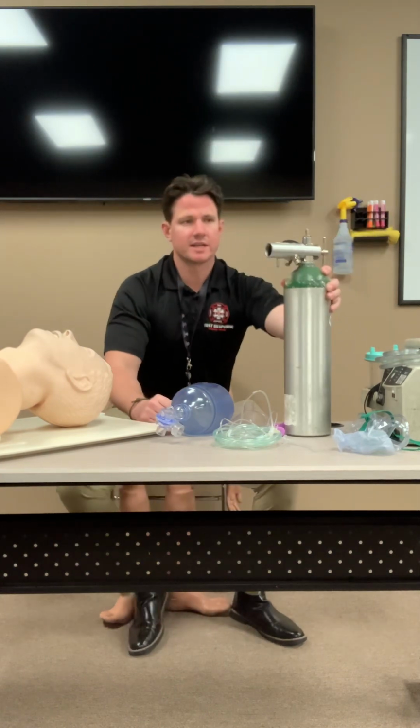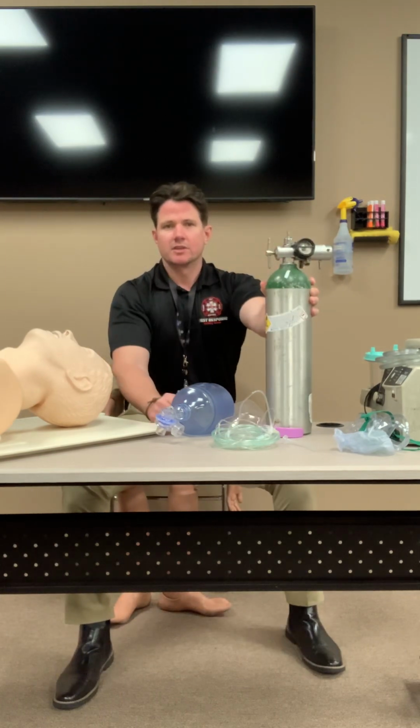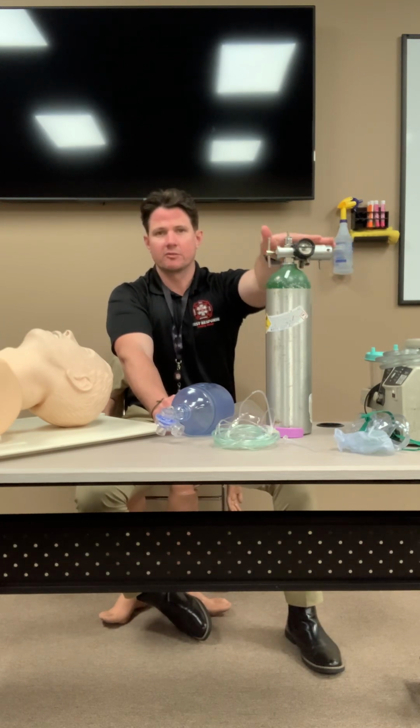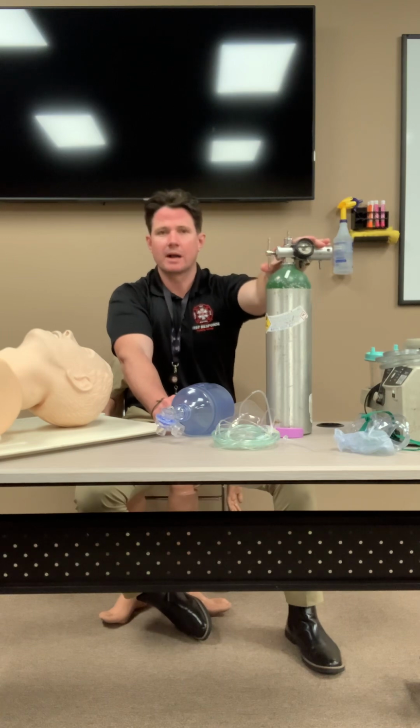Once that's on, just take a quick look at it. If you notice, the regulator is at a perfect 90-degree angle to the oxygen tank. That is a correct placement of the regulator. If the regulator is out of plumb, or out of 90 degrees, that could mean that you have it on backwards.